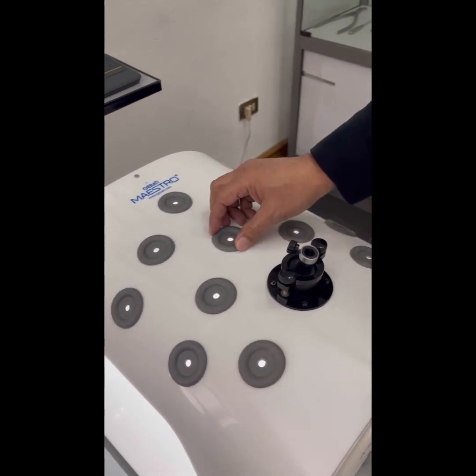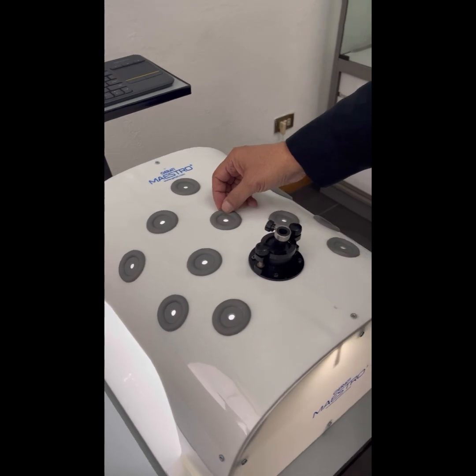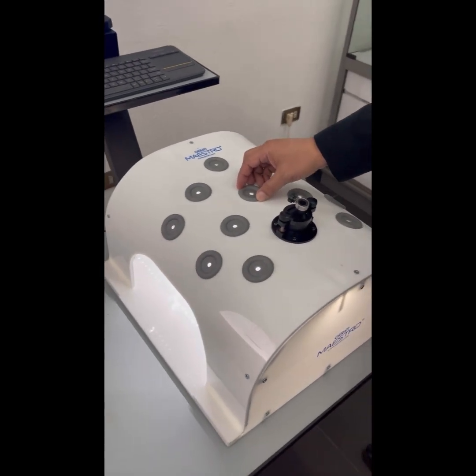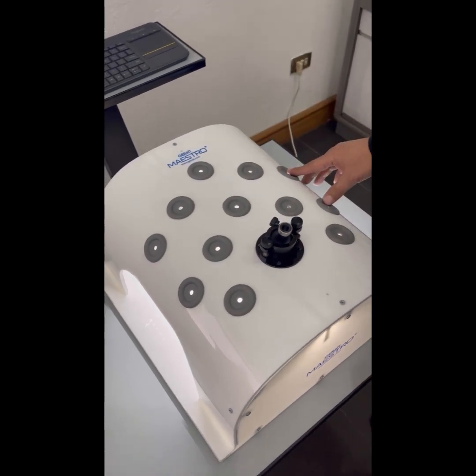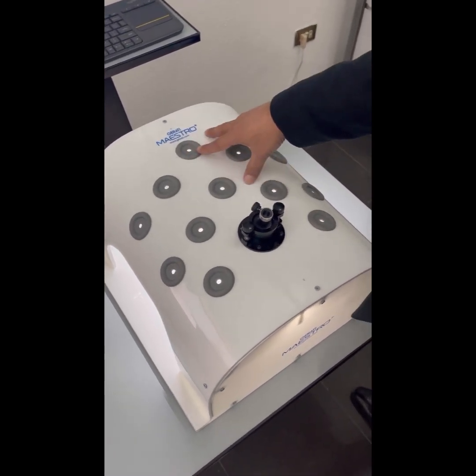The instrument insertion ports are made up of silicone material and there are 5, 7, 9, and 12 different insertion ports available.